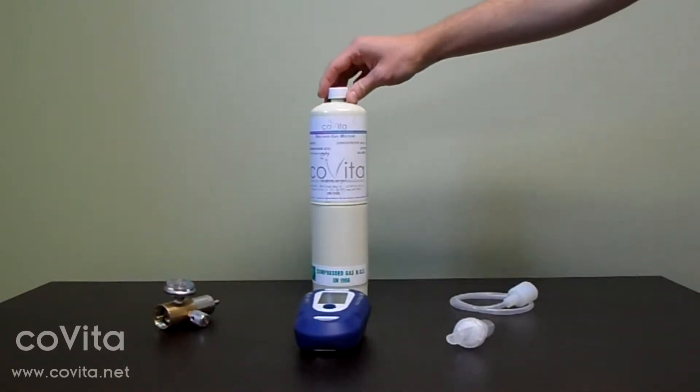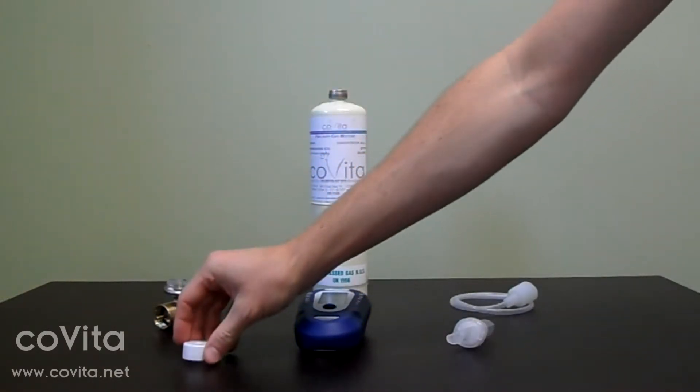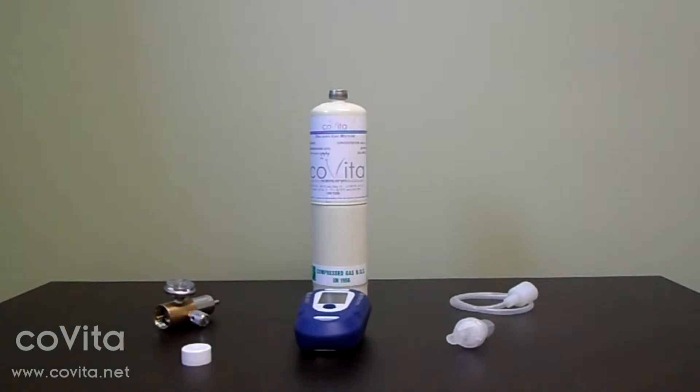First, remove the dust cap from the calibration can and set it aside. You will be replacing this when we're finished with calibration.